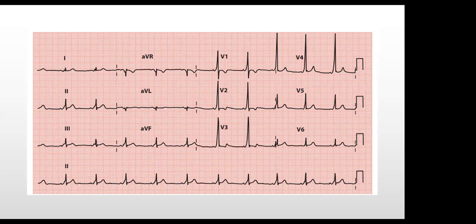Any other comment from anyone? Good evening, sir. So I think the type A, with the R wave in V1 being positive, and also the QRS. Okay. Any other comment?